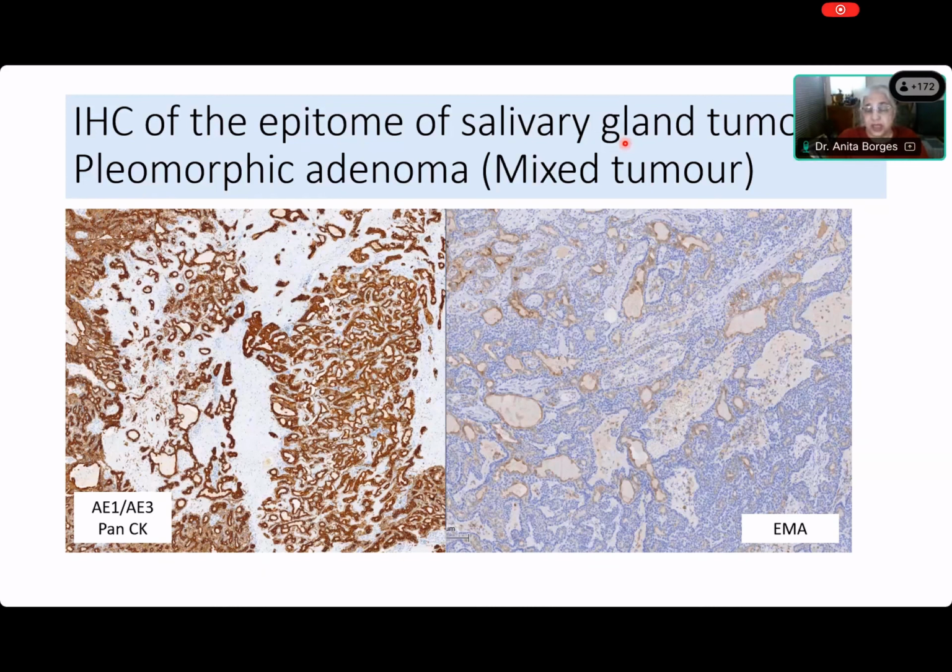All of this matrix is laid down by the myoepithelial cells, which also form these cribriform spaces and which also form the abluminal layer of those tubules. Fantastic. Akshara, you have really hit the nail on the head. It's absolutely correct that you have the myoepithelial cells, these are not true lumina.